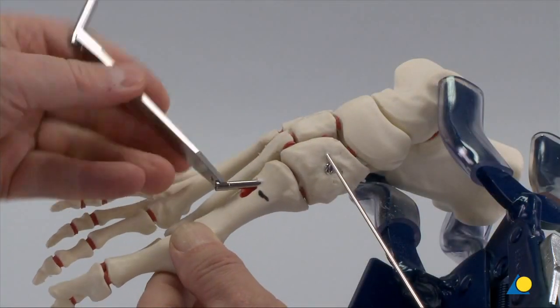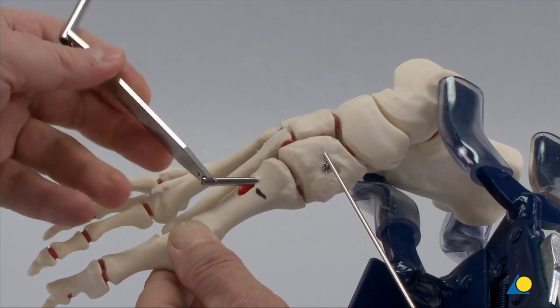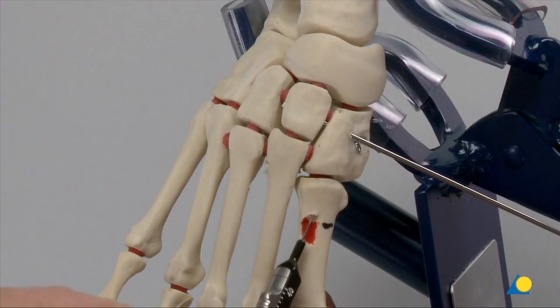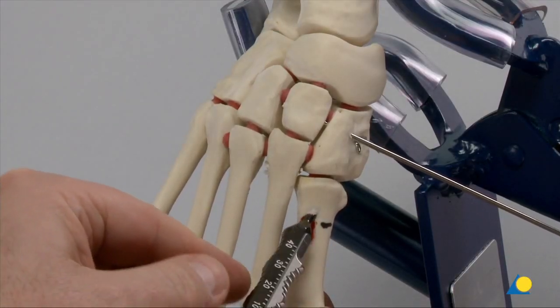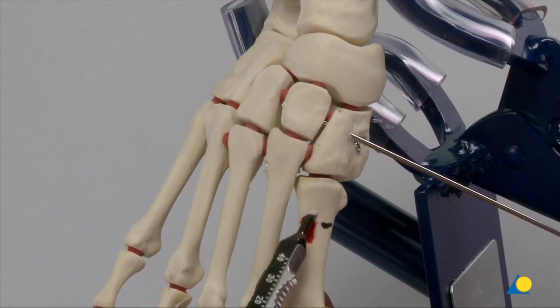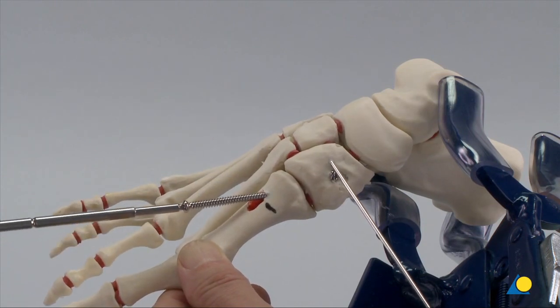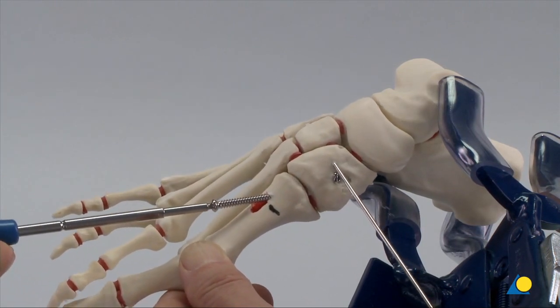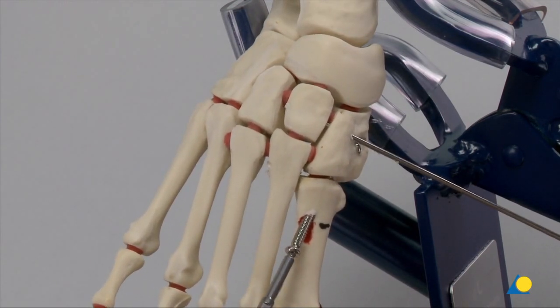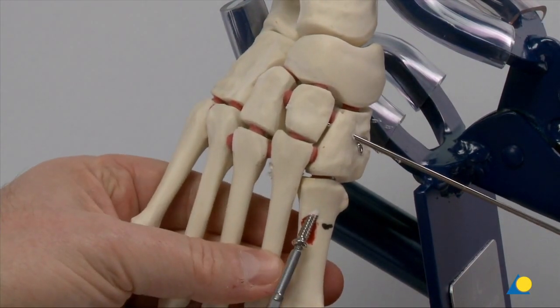After the hole has been drilled, the 2.9 mm end of the double drill guide is wriggled out of the 4.0 mm hole. The depth is measured — in this case, the length is 44 mm. The appropriate length self-tapping 4.0 mm cortex screw is inserted. To prevent rotation, one participant can stabilise the first TMT while the screw is inserted.